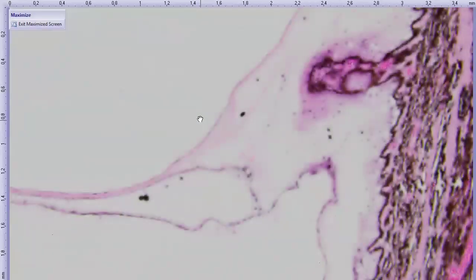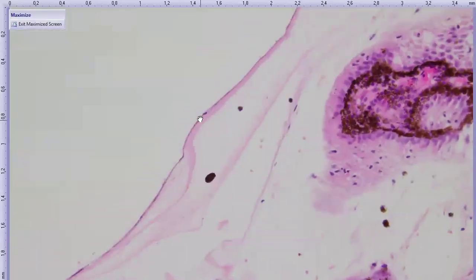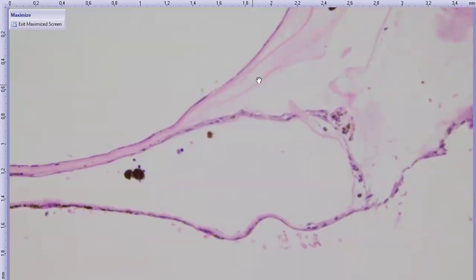So these membranes are composed of thin attenuated spindle cells that often have eosinophilic basement membrane production associated with them. These are iridociliary cysts that are very thin-walled with these attenuated cells, which are characteristic of golden retriever uveitis or pigmentary uveitis.